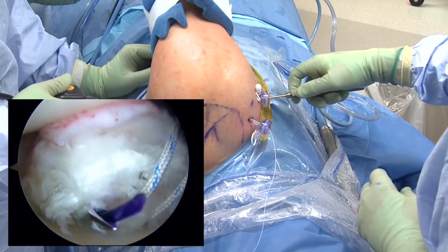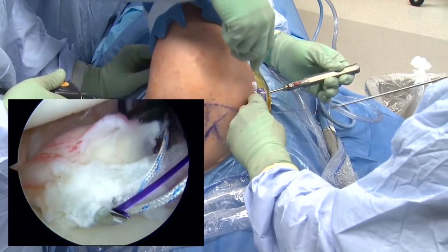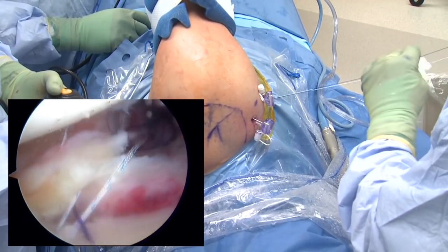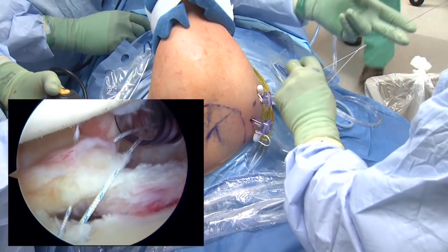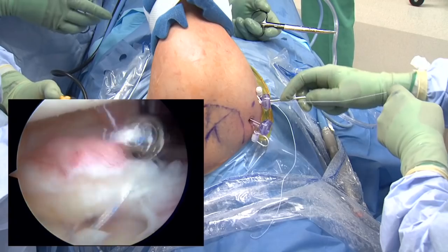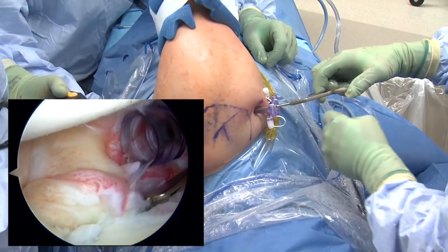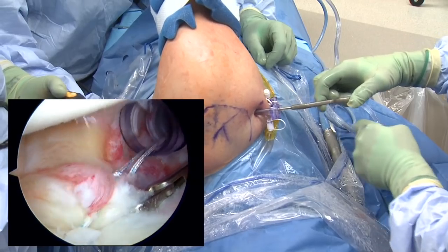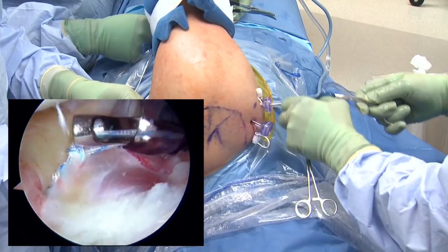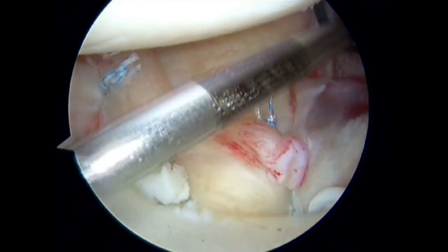We pull our PDS out, pull it through, transfer it, put a snap on it, transfer the snap to the other side, tie a knot in the PDS, and pull it through to secure the knot down. We use our passing device to ensure the knot lands on the labral side, not on the joint side, so it's out of harm's way from the joint. We do not use suture with wire in it, but rather softer suture, which is fairly strong. We do our pass-pointing here, and now we have three anchors in place.